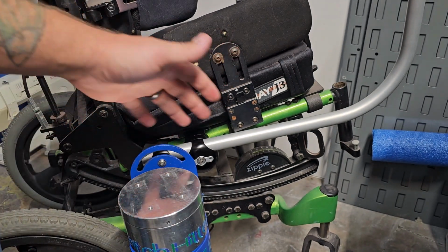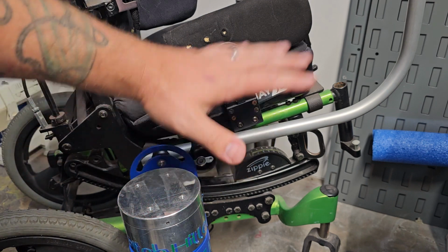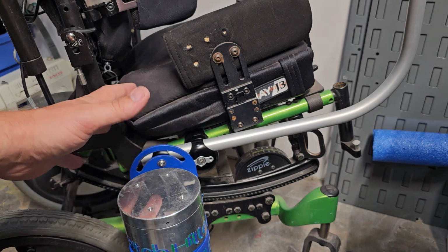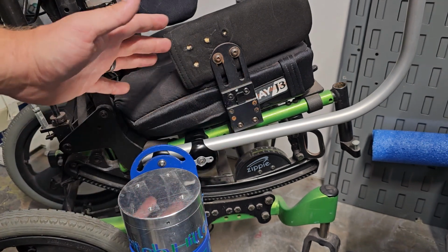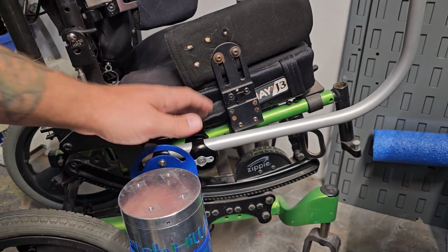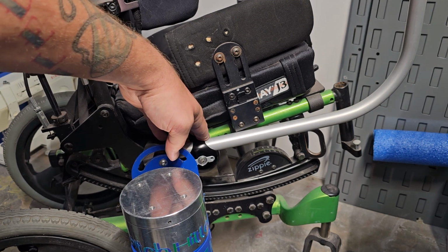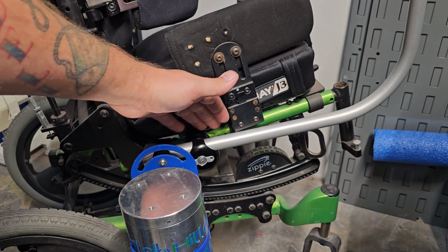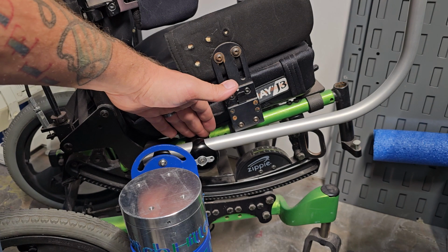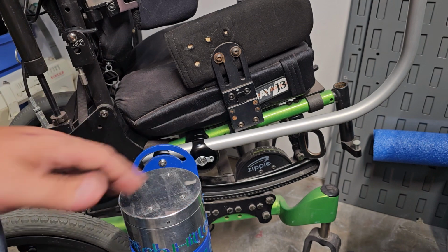I personally, when I have these set up for games or events, I just take this bolt out. I leave everything attached the way it is and store it that way. Then when I need it again, I just bring it out, one bolt, and it's already on the wheelchair. And again, I leave these brackets on the wheelchair. These brackets are also the same that is used for the Tobii Dynavox communication systems. So if a user has a Tobii Dynavox and has one of these mounts on their wheelchair, it is compatible with them, so you can use that instead of these as well.